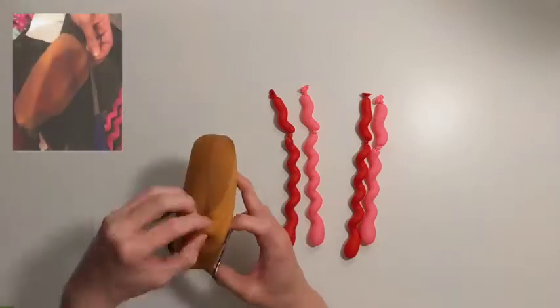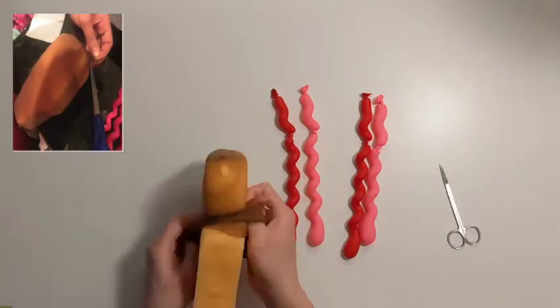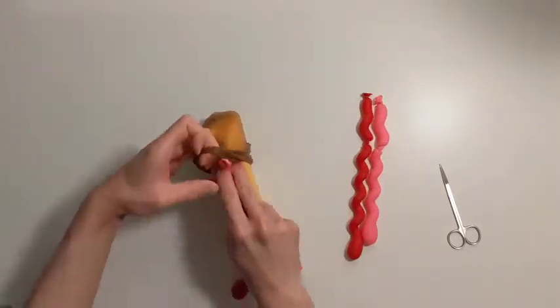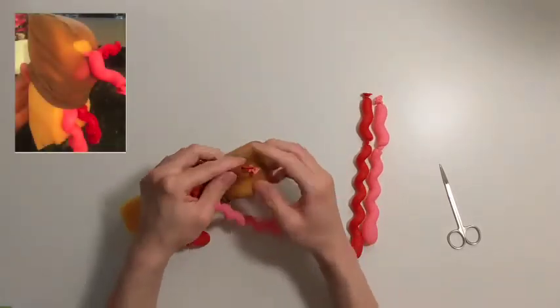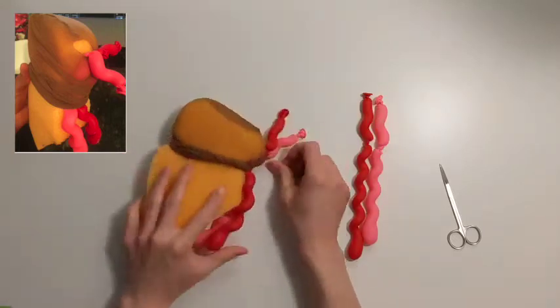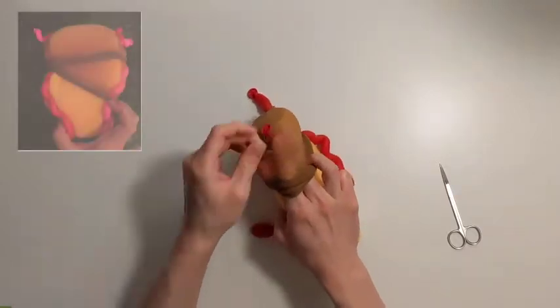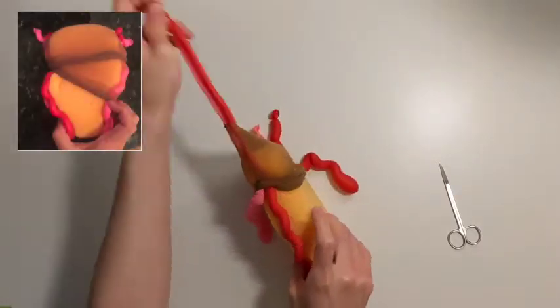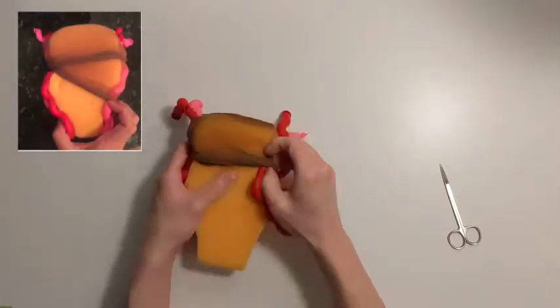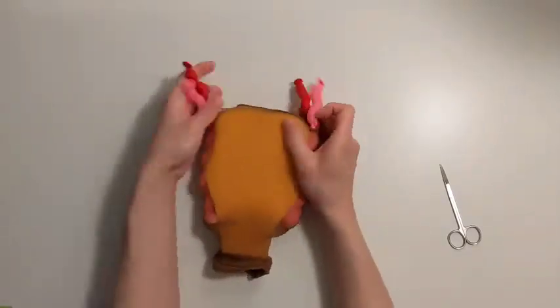Now we will attach the uterine vessels to the model. Cut a small opening at the superior corners of the knee highs. Then roll the knee highs up about 3/4 of the way and snake the tied ends of 1 pink and 1 red balloon up to the end of the knee highs. Feed the balloon through the opening so that the second tie is at the opening you just created. Repeat this on the other side. Roll the knee highs down to hold the balloons in place.